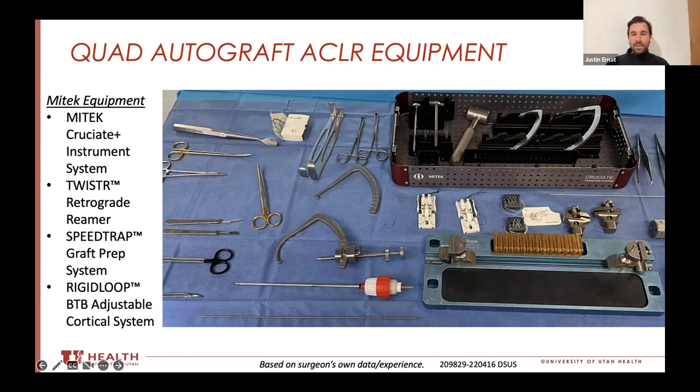The actual guide itself is all one piece as opposed to two pieces, and everything else can lock and ratchet in place. It allows for efficiency during surgery in that you can put the guide on the knee and don't have to have someone actually holding the guide while you drill.